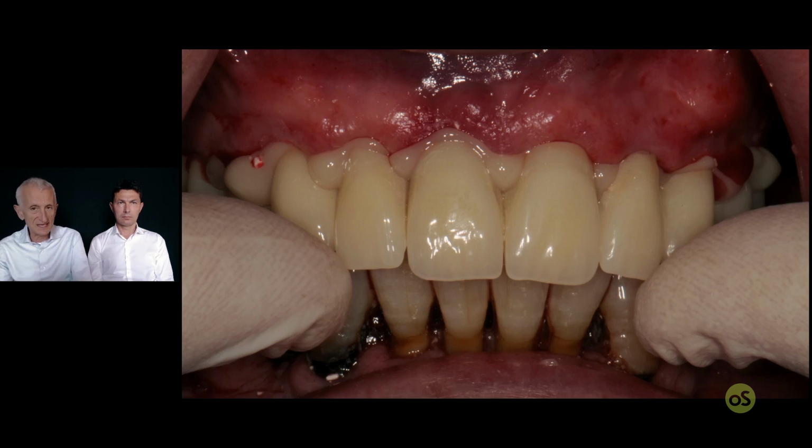When everything is set, the material is hardened. Before you remove it, you can check with some articulating paper if there is any misfitting, and probably prematurity. And so, if there are any, Gianluca can work on this to finish it and also adjust the occlusion.